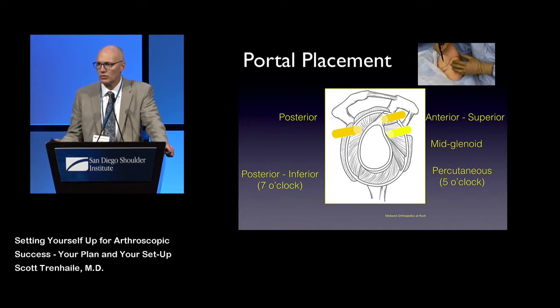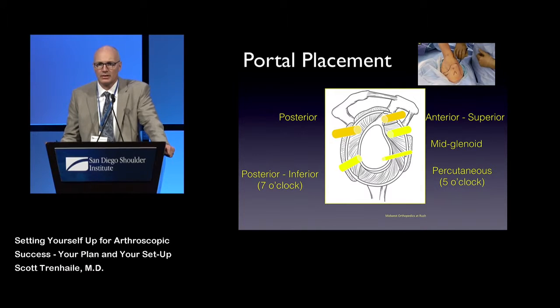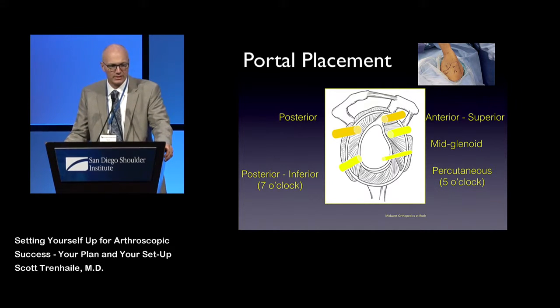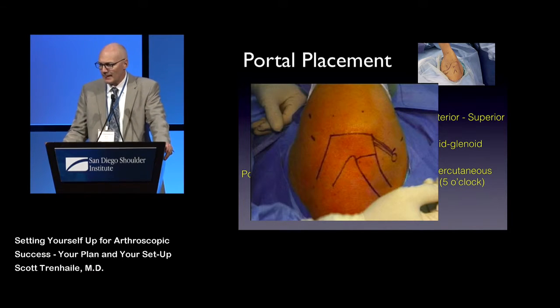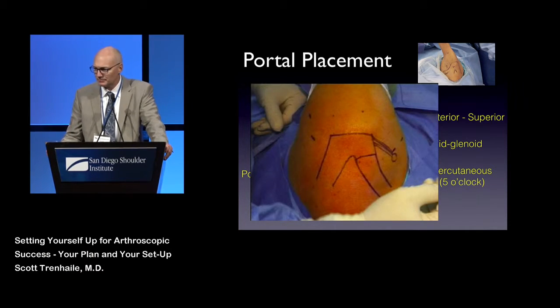These are your basic workhorse portals, of course. But I think it's important to try to learn in the lab about the 7 o'clock portal and even the percutaneous subscap portal as we get more aggressive with doing things arthroscopically and get more comfortable with addressing things in these tougher to get locations down low. And draw out the markings every time, because certainly these are situations where the morphology is different in every patient, and you get all different sizes and shapes with this.